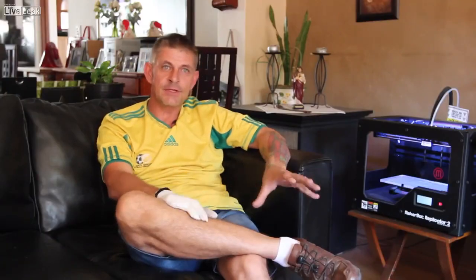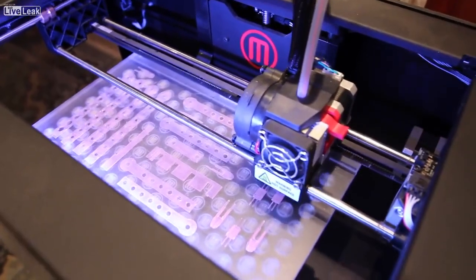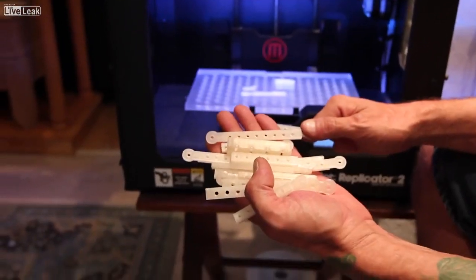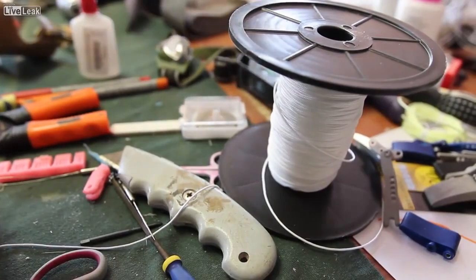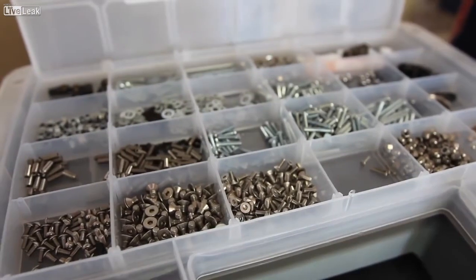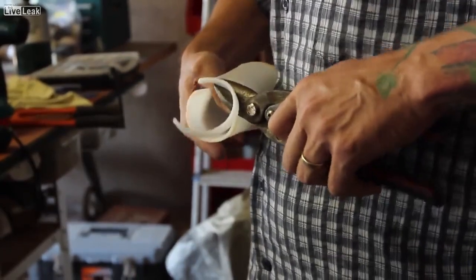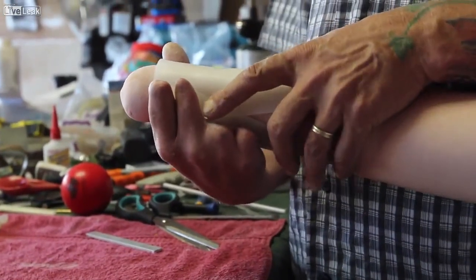Everything other than three different things is made by the MakerBot — all the fingers and phalanges, the tips, the thumb, the knuckle block, and the wrist hinges are all printed. The only things we add are cabling, stainless steel hardware, and thermoplastic. You cut the piece you need to size, put it into hot water and it goes translucent, take it out, and it moulds to the exact shape of your hand.